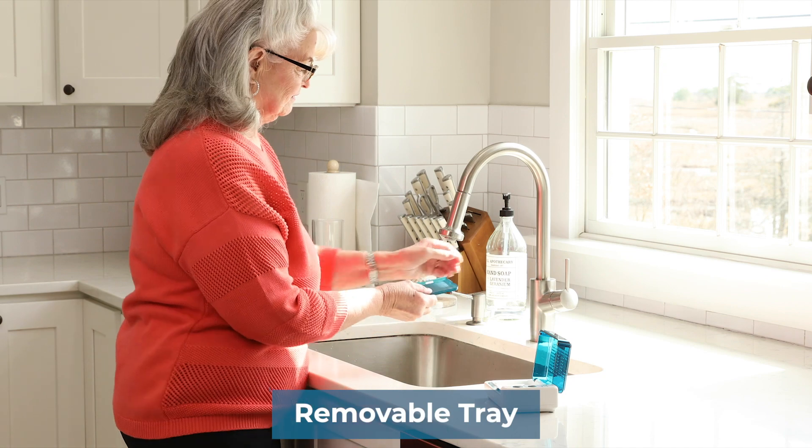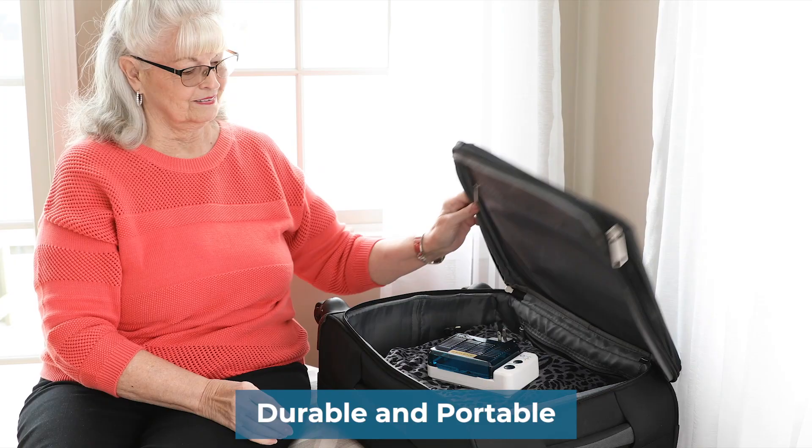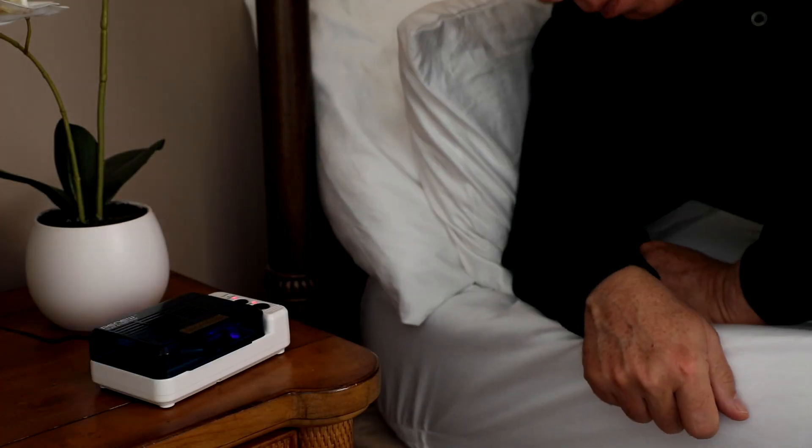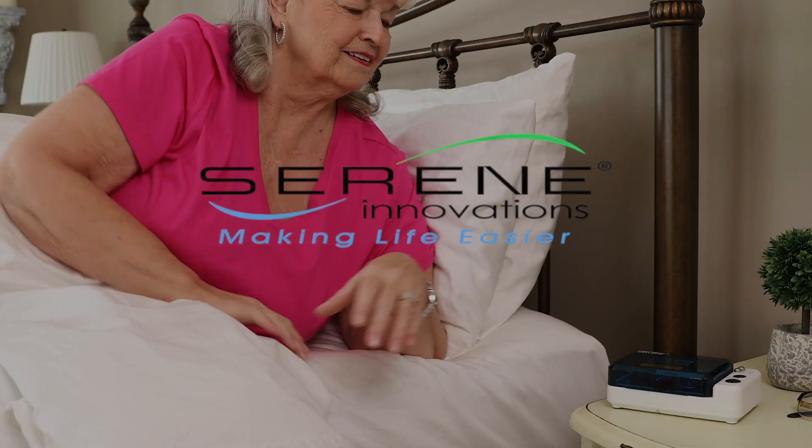This dryer has a removable tray for easy cleaning and is so durable and portable you can take it with you anywhere. Include this dryer in your daily routine and your hearing aids will last longer and you will hear better. Serene Innovations, making life easier.